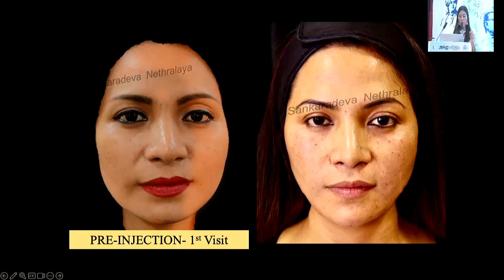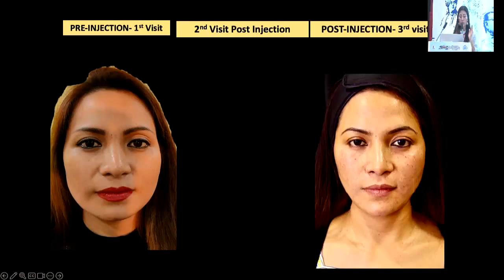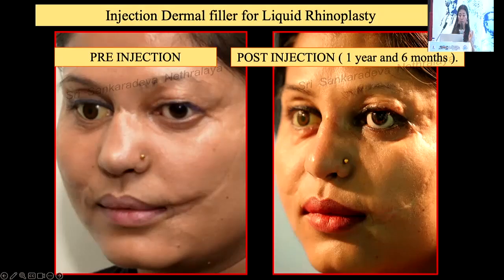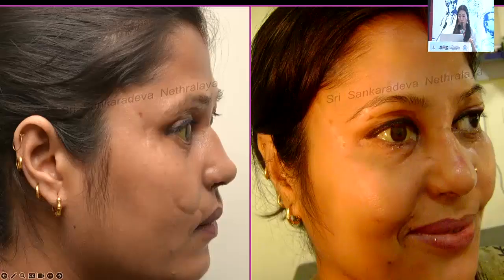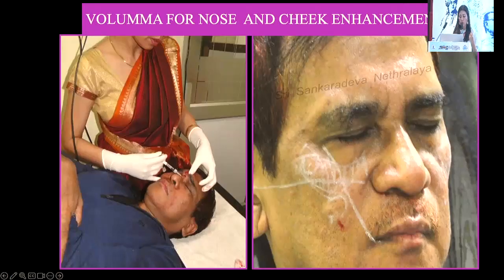Like this is some of the patient where only a mid-face filler has been done, mainly concentrating on the CK points, and you can see without touching the other point, you can see a very beautiful correction, a very good lifting of the face or the ovalization of the face. And as Debraj has already mentioned about the liquid rhinoplasty, this has become a very common indication, especially those patients who have a deformed nose because of trauma, or as a cosmetic indication, and a very good way of lifting the tip, which Debraj has already shown so beautifully.